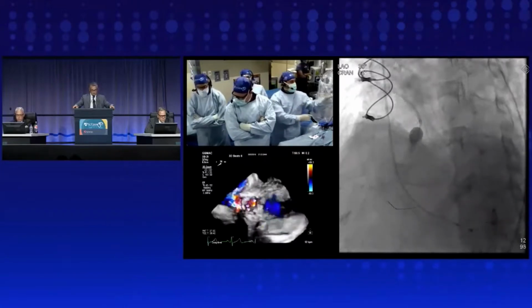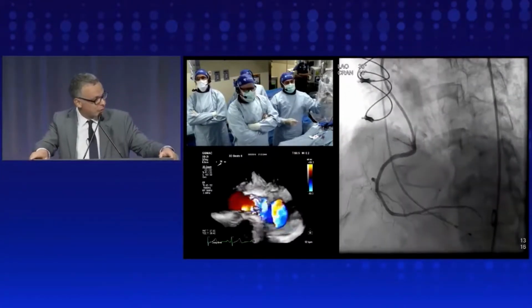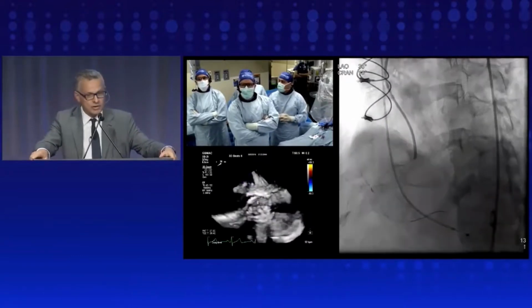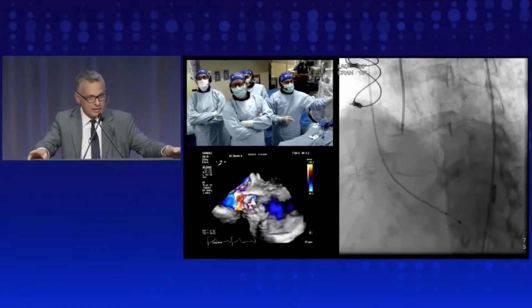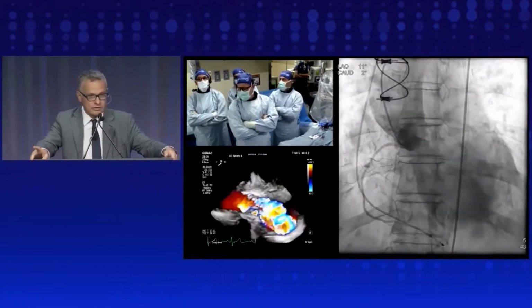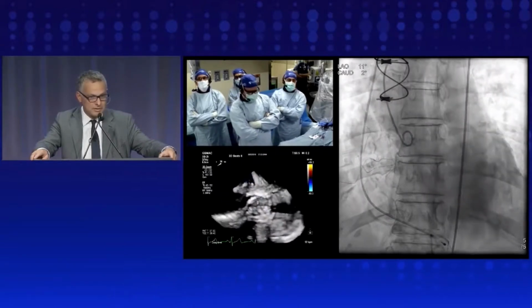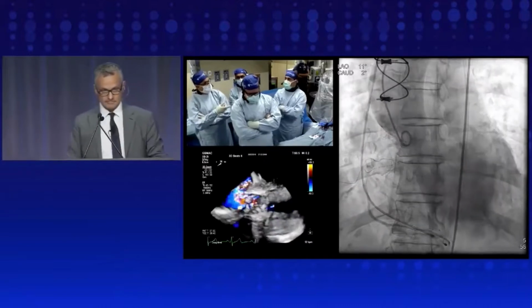I'm sorry, Francesco. Since you stopped talking for a second, I just want to ask you one single question. I see you using a Sentinel. In this particular case, is it standard practice for you, or do you do this just because of this very complex Basilica procedure? Well, Jamie, you're talking about Sentinel, right?